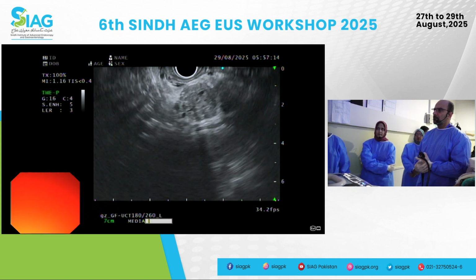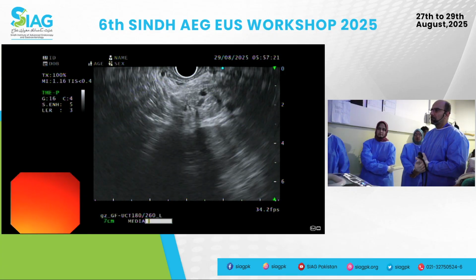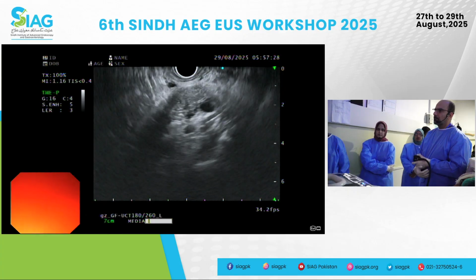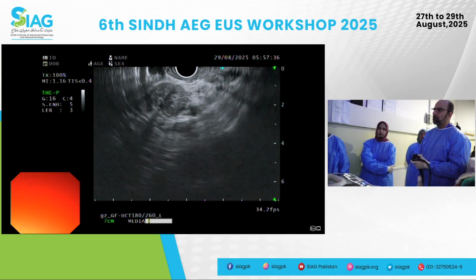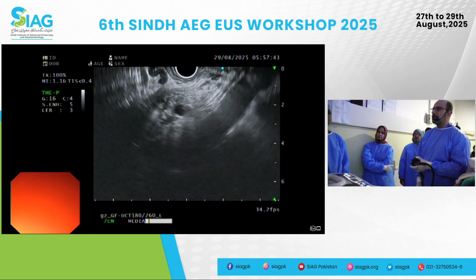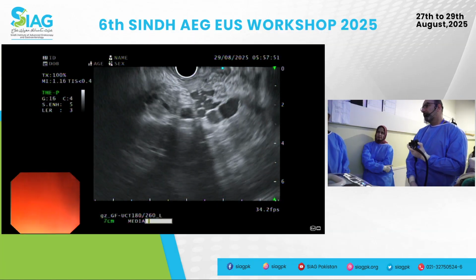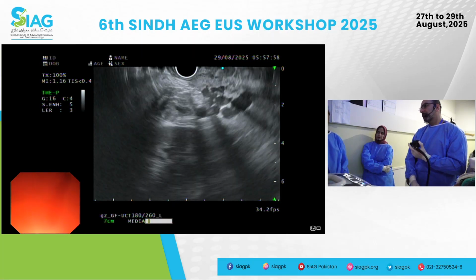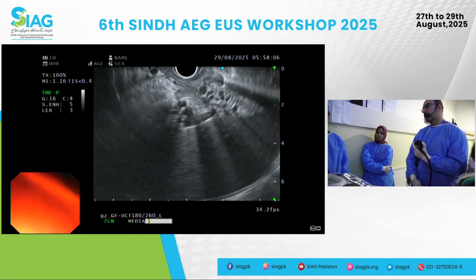And the bottom line is, if you really have to do a biopsy, find the best place, be it stomach, be it duodenum, where you're going to be far away from the main pancreatic duct. That's the main thing, and try to minimize the number of passes, be it 1 or 2, but do not go close to the pancreatic duct. Yep. And also all of those, but especially the pancreas which does not have a cancer. Any scenario, but when it's a cancer, you're going to get away even if you stick a PD. But in any other situation, stay away from the pancreatic duct to prevent the leak.